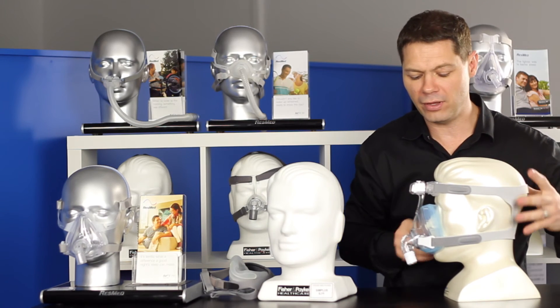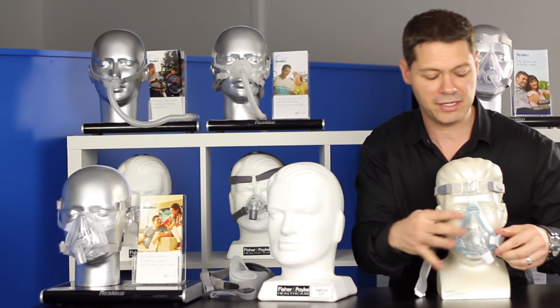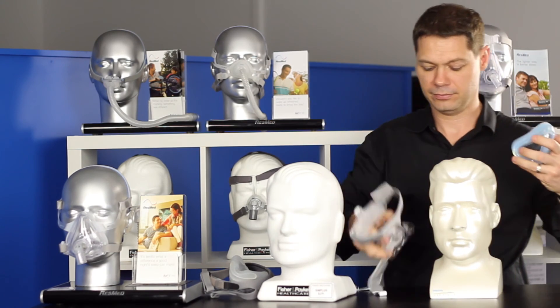But the new version of this has a blue gel cushion, which means the mask has a gel pad and it is very, very soft on the face. This is a big upgrade to the initial Amara that they had before, and it brings them into real contention now as a great mask.